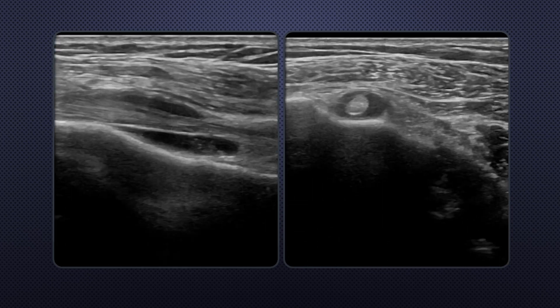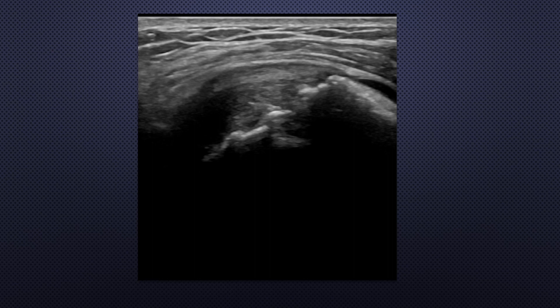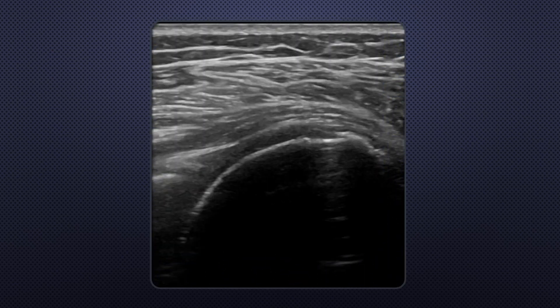An ultrasound image along the long biceps tendon shows bicipital fluid. Long axial image along the subscapularis tendon shows marginal erosion in the lateral edge of the articular surface and degeneration in the distal tendon. Long axial image along the supraspinatus tendon shows cortical erosion in the tendon footprint of the greater tubercle and degeneration of the supraspinatus tendon. Short axial image along the biceps tendon, supraspinatus and subscapularis tendon shows diffuse irregular cortical erosion and tendinosis.